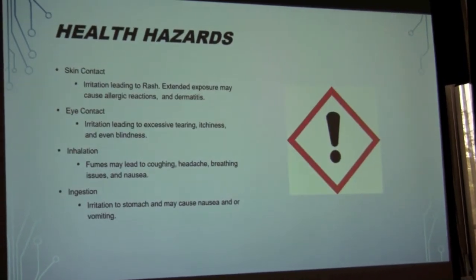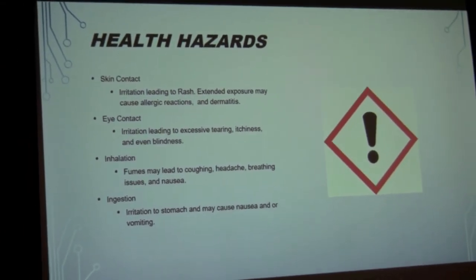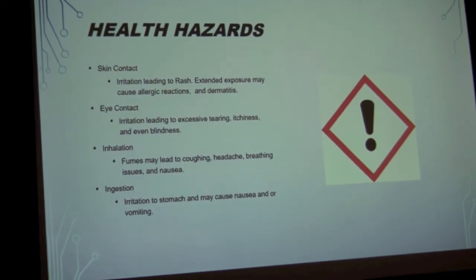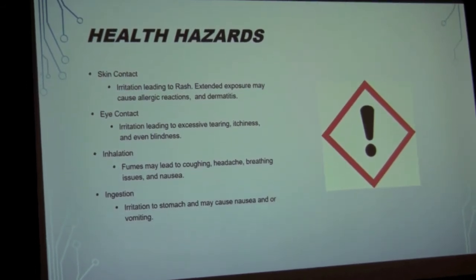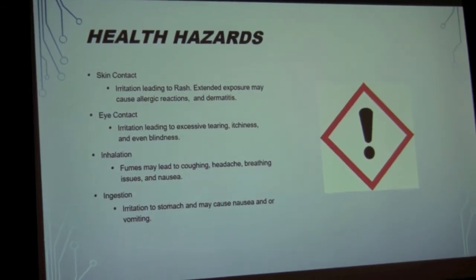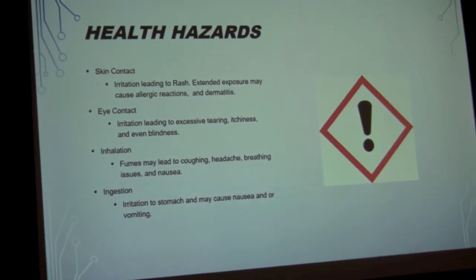So there are health hazards with resin. If you touch it with your skin, you can easily get irritations and rashes. You can even have loss of sensitivity on your fingertips. So whenever you're handling the resin, please put gloves on. If you put it in your eyes, don't. It's not eye drops. I mean, you can go blind from it.